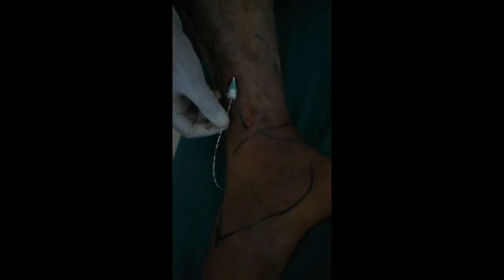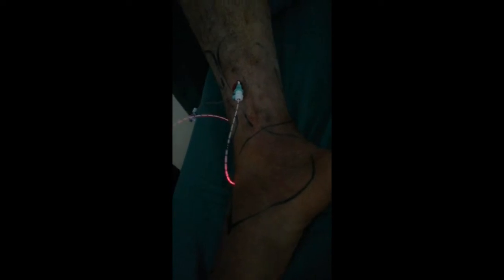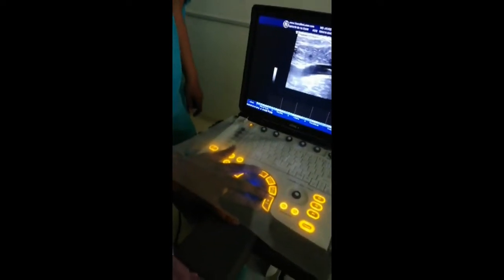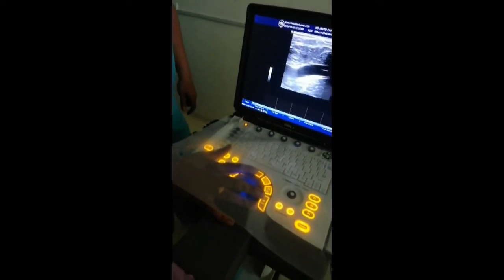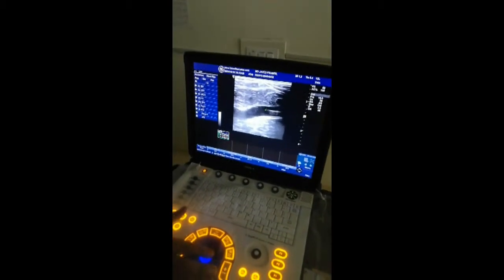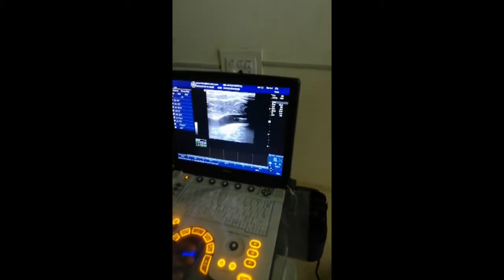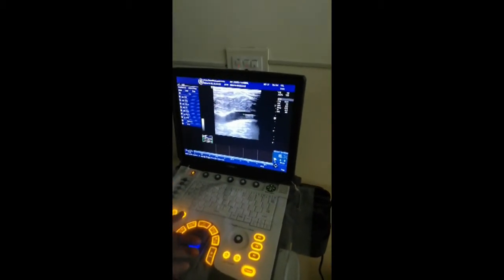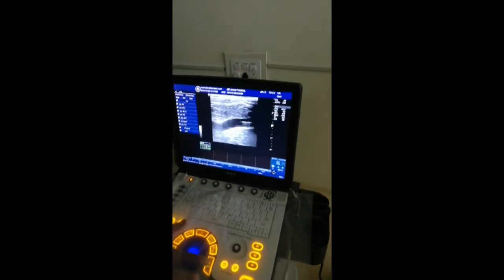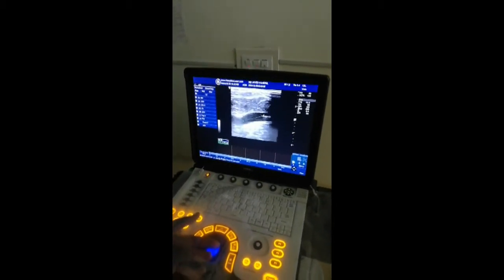We can see the backflow of light along the radial fiber, which is a signal for us once we reach the saphenofemoral junction. The assistant now measures the saphenofemoral junction from the tip. Going back and coming back — yes, from the tip to the saphenofemoral junction. If you see carefully, we can also see some flow.